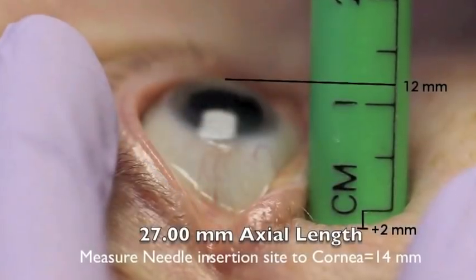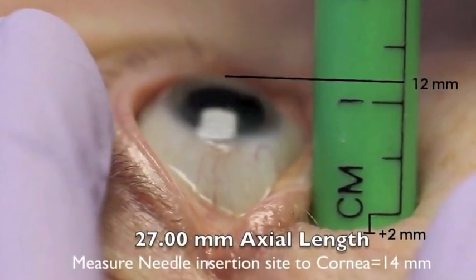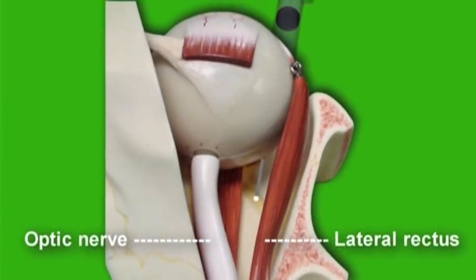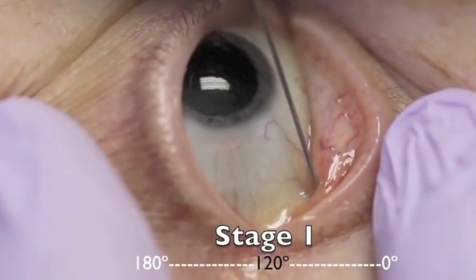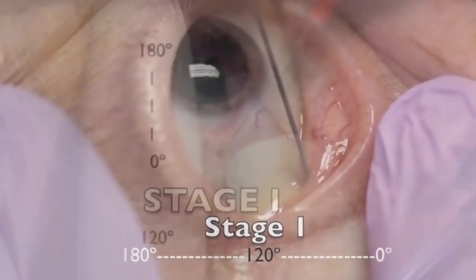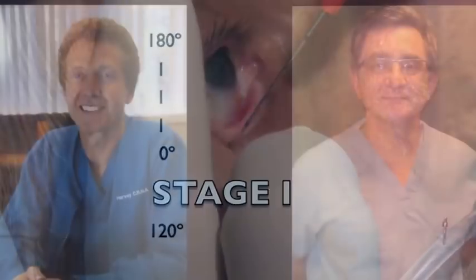We have produced this video to provide some guidance to those beginning to perform orbital regional eye anesthesia. We start with a five-minute segment on the anatomy of the orbit and then finish with the clinical technique of administering the eye blocks through both transconjunctival and transcutaneous approaches. We hope this brief video will be of help in showing the anatomical principles behind administration of safe and effective peri-retrobulbar blocks.